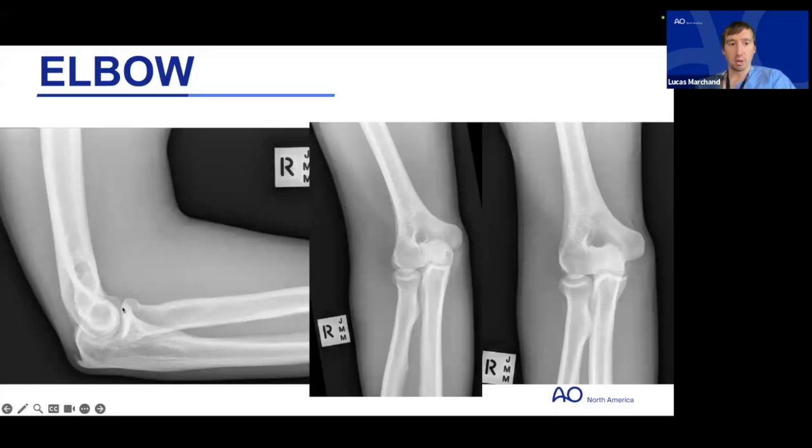A good lateral of the elbow, we're going to talk about here in a few slides, has a nice look at the proximal ulnohumeral joint, as well as demonstrates a nice alignment of the radius relative to the capitellum. The capitellum is identified by this near perfect circular structure when a good lateral is obtained. Then you get an oblique and AP views. They give you slightly different profiles of the articular surface of the distal humerus as well as the medial epicondyle, as you can see contrasting here.